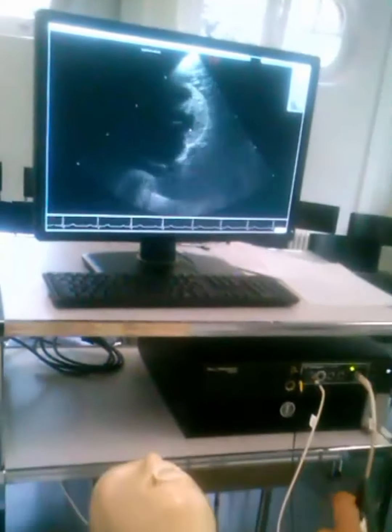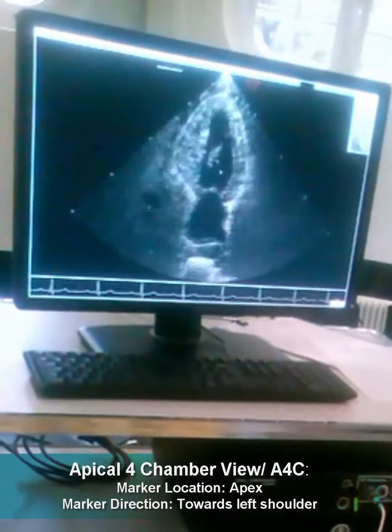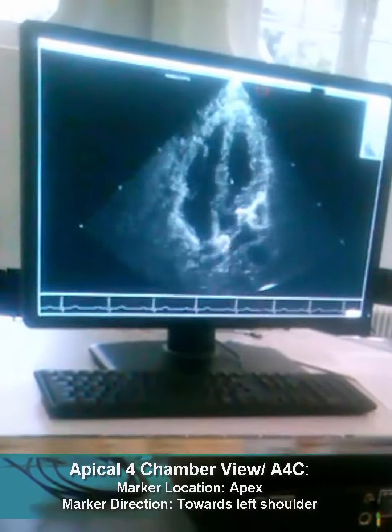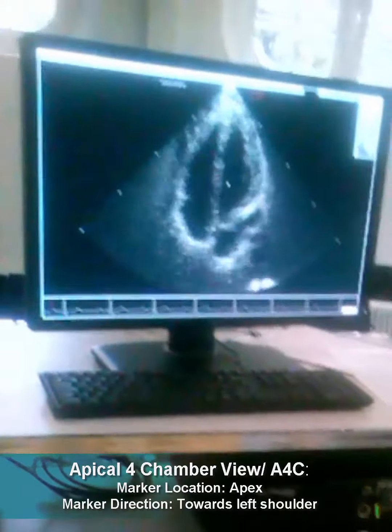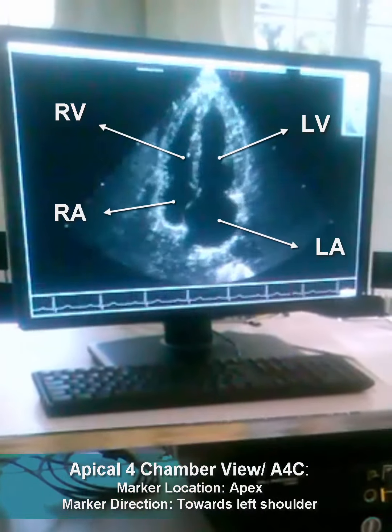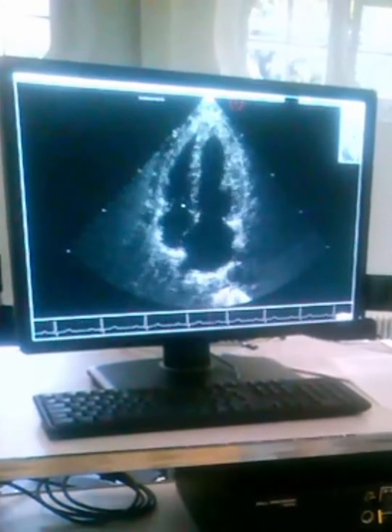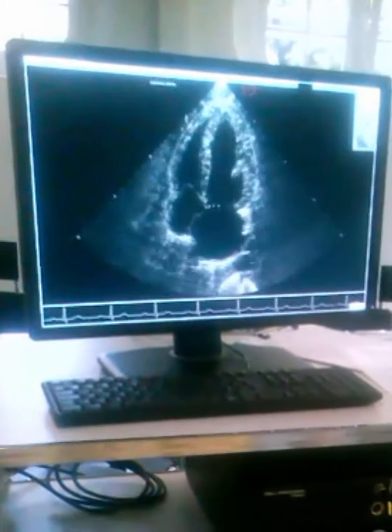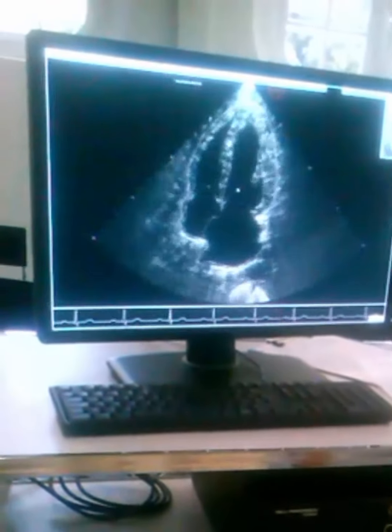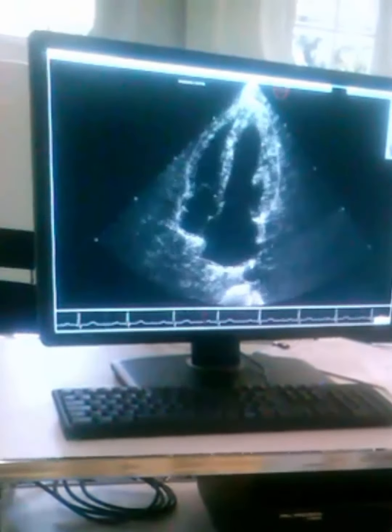Now we will move to the apex of the heart. You can see the four-chamber view now: left atrium, left ventricle, right atrium, right ventricle. As you see, the level of the tricuspid valve is positioned more downward than the level of the mitral valve — so this is the left side, this is the right side. And these are the pulmonary veins and this is the descending aorta.